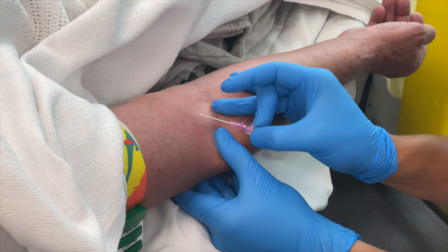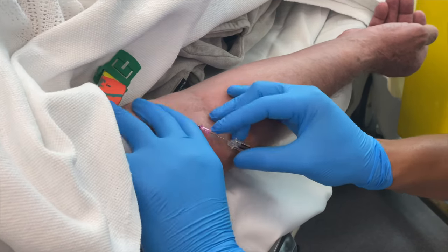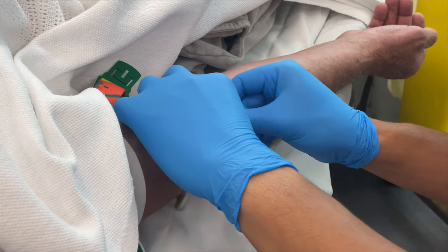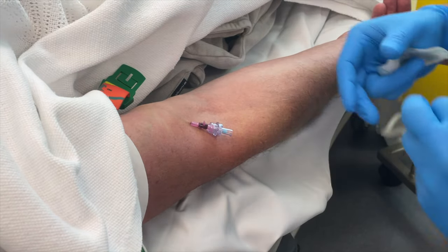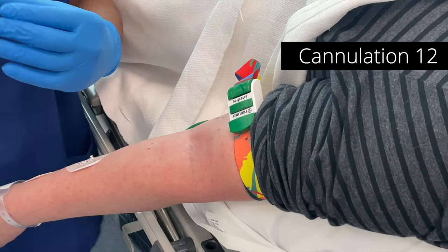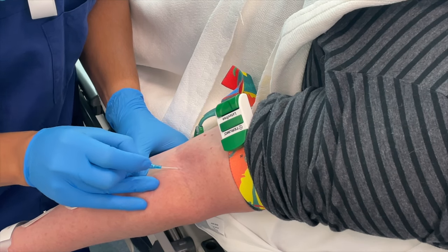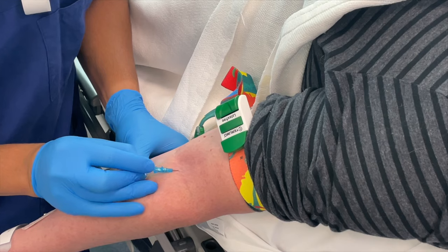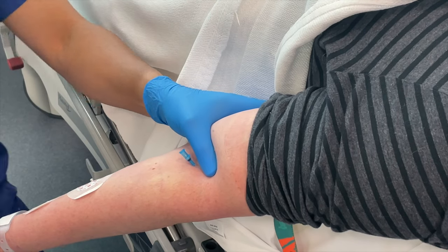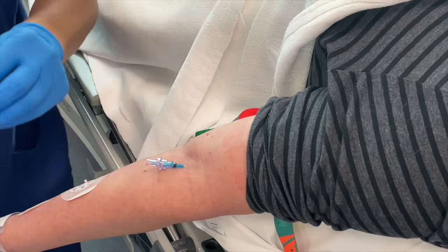The B. Braun Intracan Safety Cannula is a fantastic cannula because it's very stable — when I advance the cannula it doesn't rotate, making it very easy to advance with my pointer finger. You can see the low angle I was using to insert it, and I really want to make sure I don't go through the opposite side of the wall. I get my thumb out of the way, go at a really low angle, then apply pressure proximally to stop blood flowing back, jiggle the bung on, and once it's secure I flush to make sure it's in.